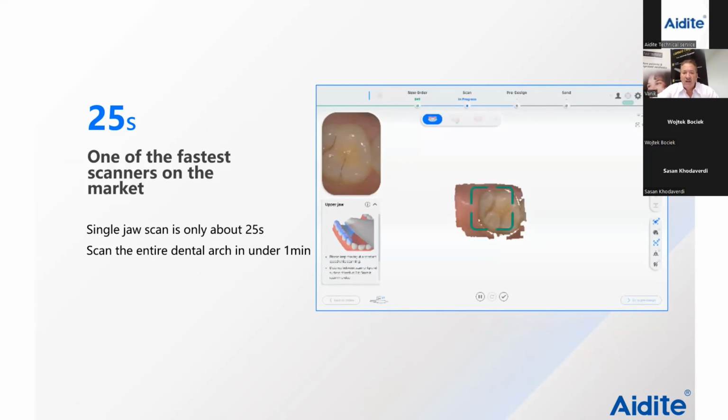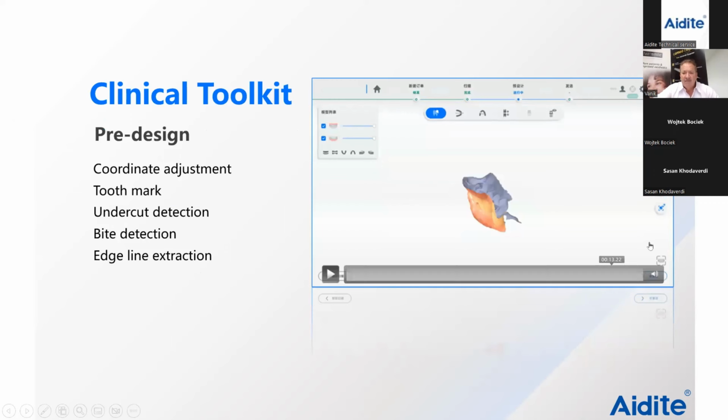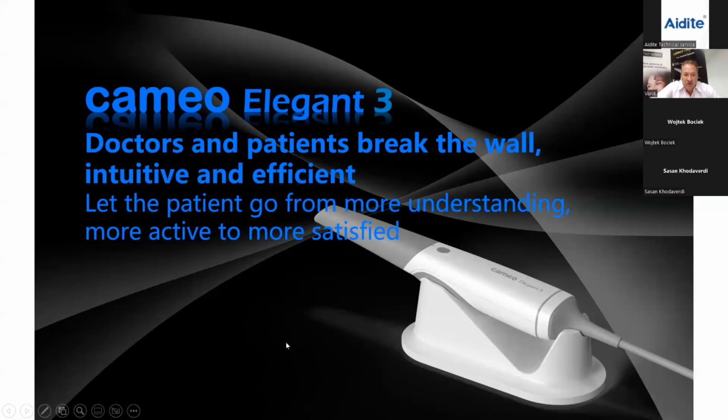It's just how much routine you have. We have the clinical toolkit. What this toolkit means, I'm not going to go into it, is the dentist can draw the prep margin. It can show you the undercuts, all those kinds of things. Most of the dentists don't have time because they're a system scan, and then they don't have time to draw the prep margin. So you don't have to use it if you don't want, but it is all there.